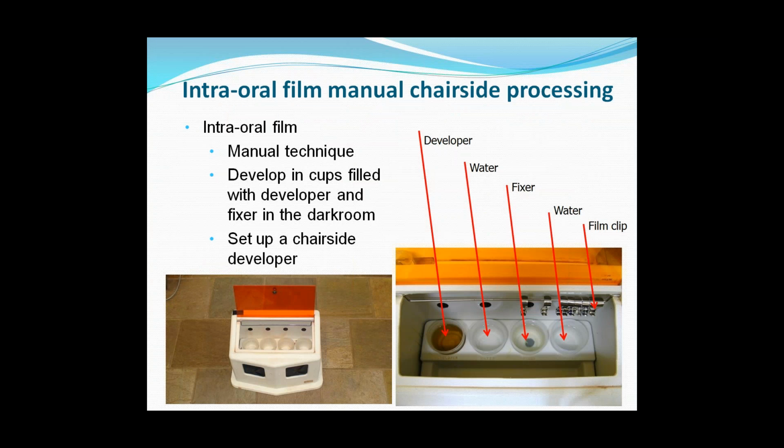So the way to get around that would be to set up what's called a chairside developer. Essentially, it's called a chairside developer because it's used chairside by the dentist, because if you think about it, when you're at the dentist, you're actually lying down on the chair.